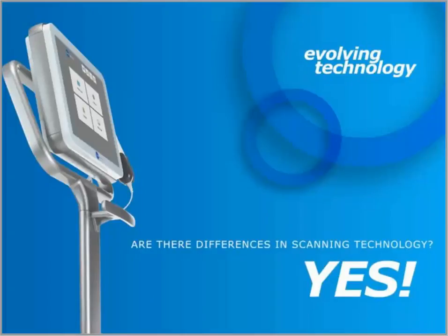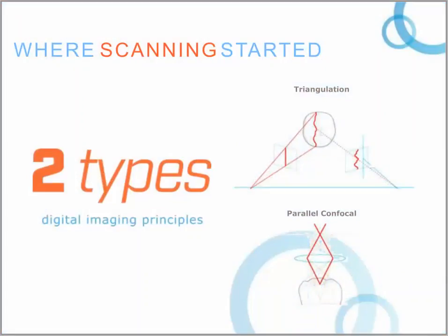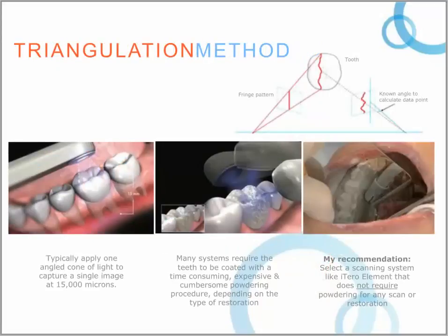I'd like to start with an overview of what the original scanners really were. There were really two types. One was a technology called triangulation sampling, which you see on the screen on the right-hand side, and a second technology called parallel confocal. I'd like to contrast those two technologies because they really were where we started. With triangulation sampling, as you can see on the screen, we used a beam of light that allows us to capture information at a certain focal length.